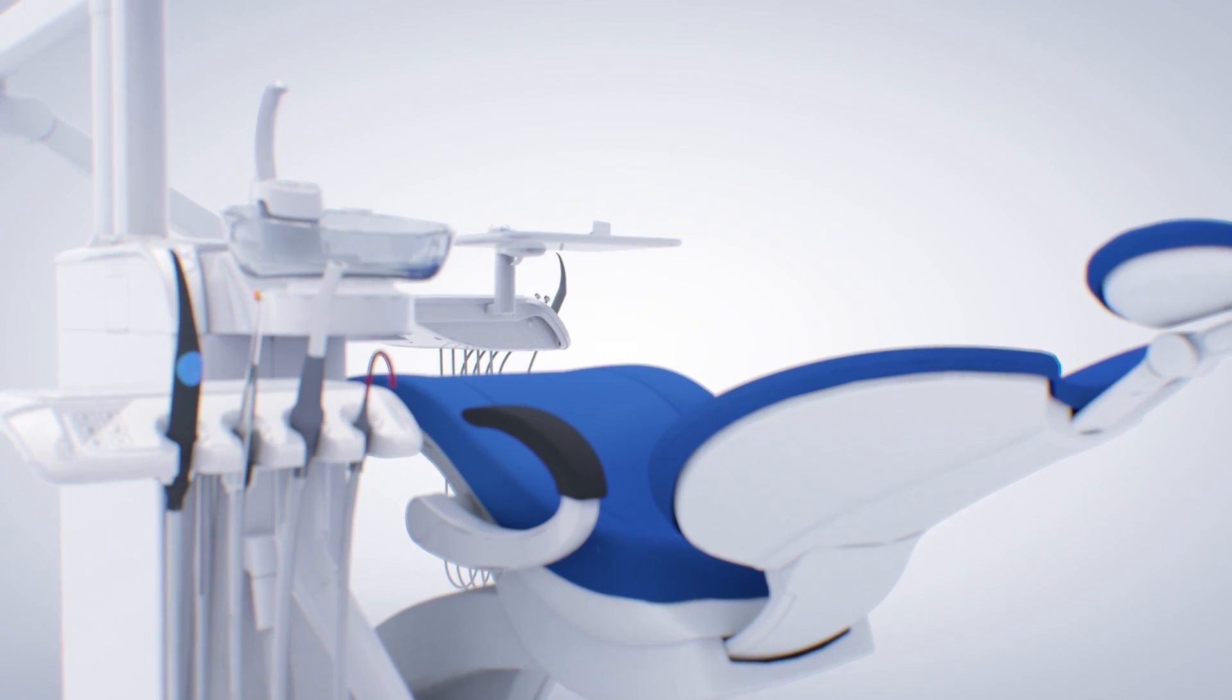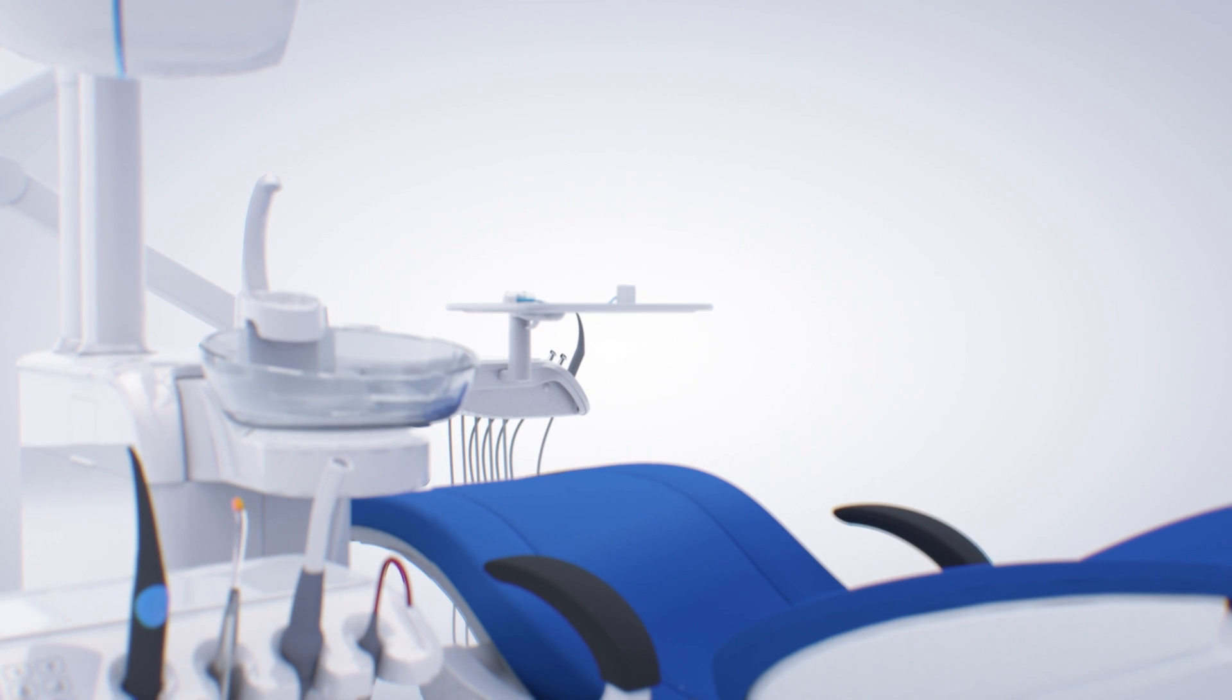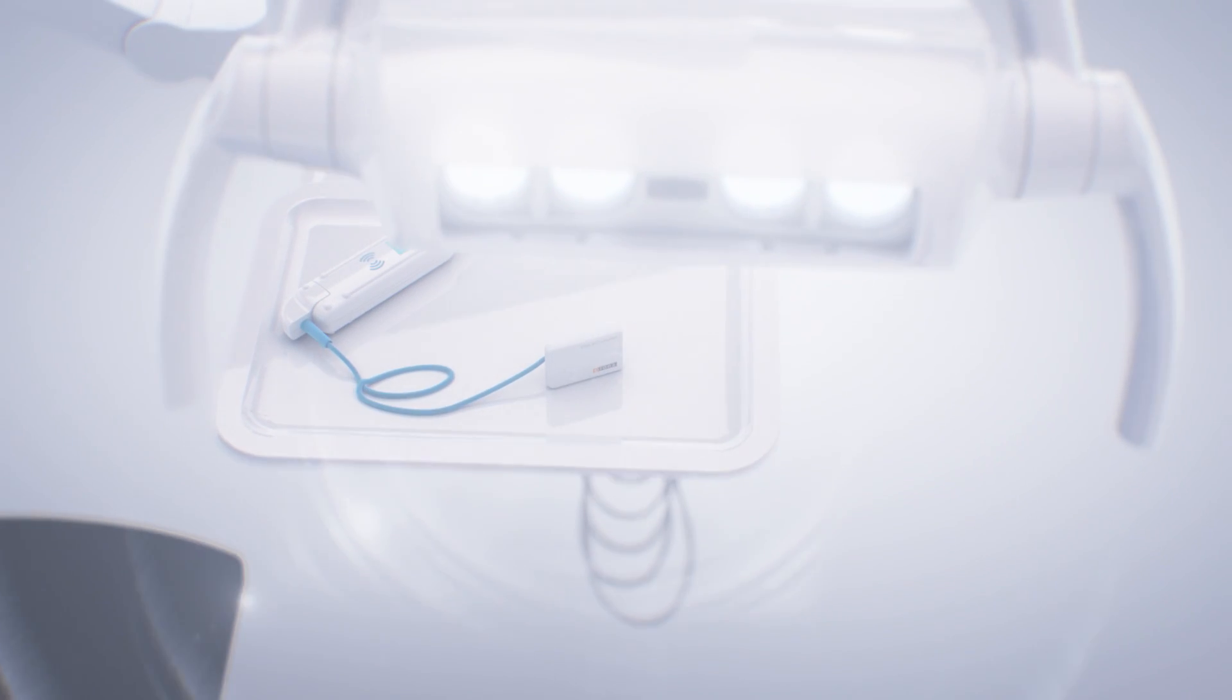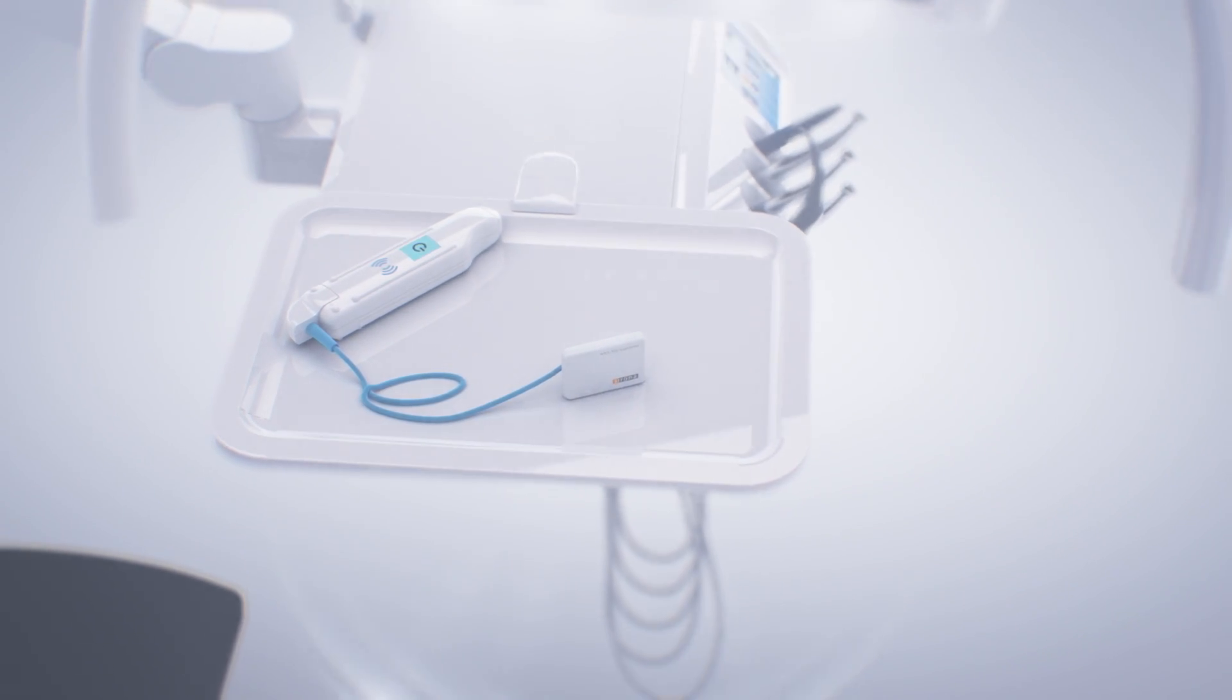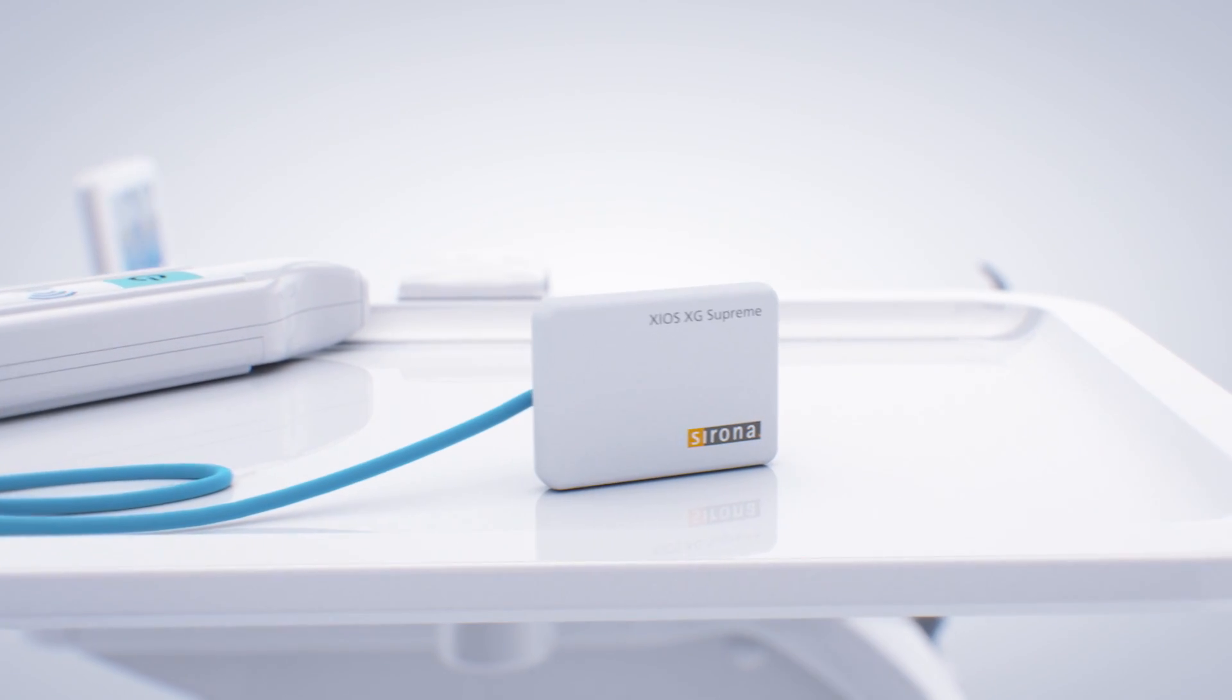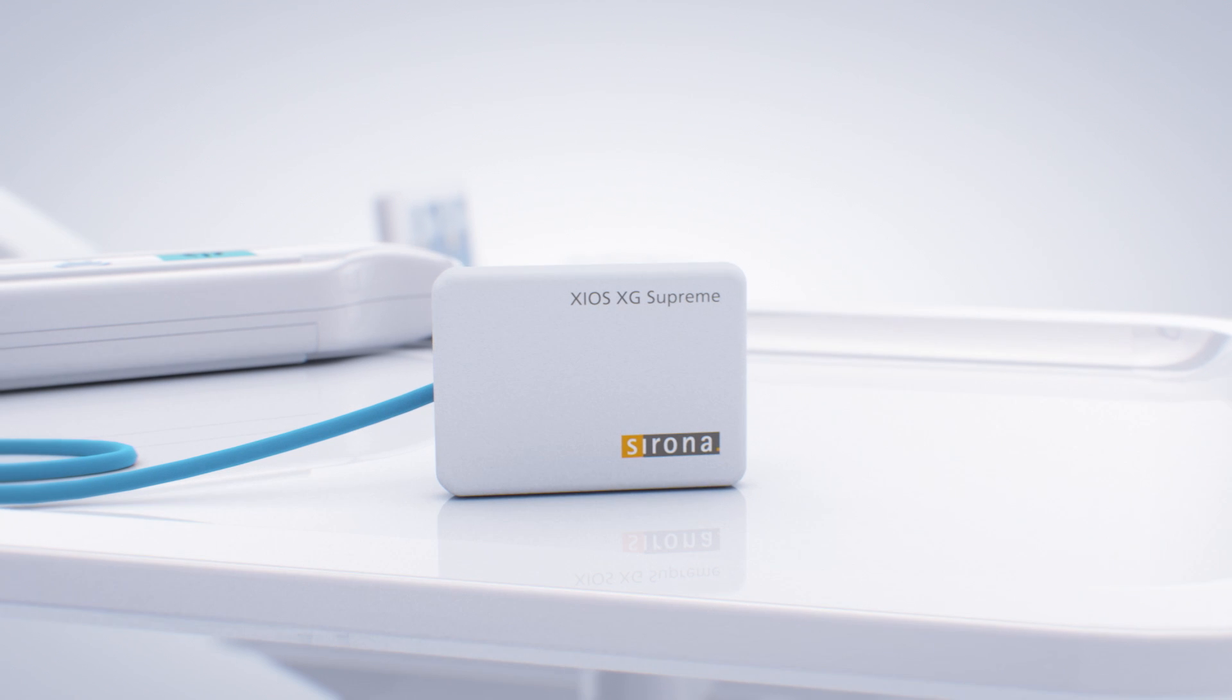True efficiency means minimal movement and no waiting time. Combined with incomparable image quality, the result is a digital intraoral imaging solution that optimally supports every diagnosis.